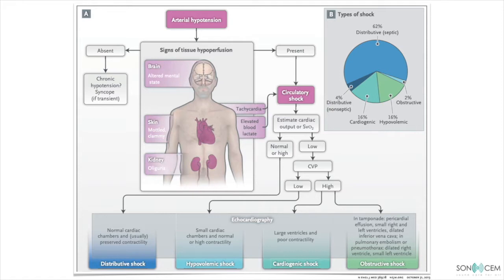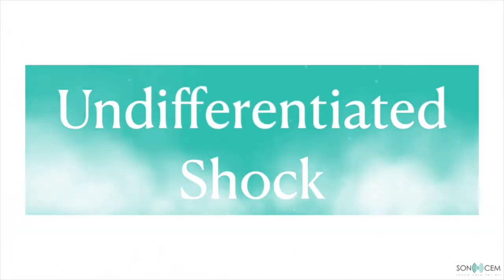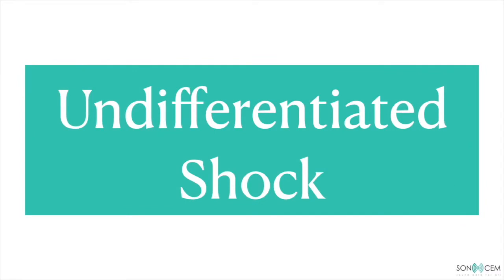So what is the role of point-of-care ultrasound? PoCUS acts as an adjunct to differentiate the type of shock by assessing mainly the heart, lungs and also abdomen. And this is very pertinent in the emergency setting because we normally deal with undifferentiated shock as patients land in our department acutely without prior history or clinical information.